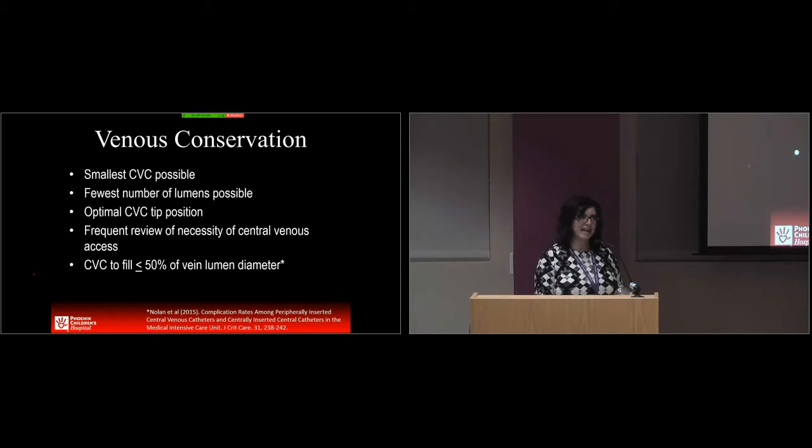The problem is that if you need a power injectable catheter, the rates are not always as high, but again, there's a new line coming out where you can power inject smaller diameter catheters. So we will be using those in the near future.